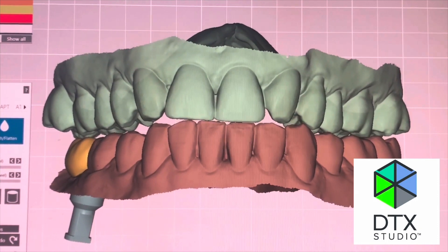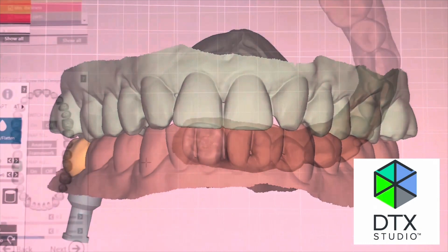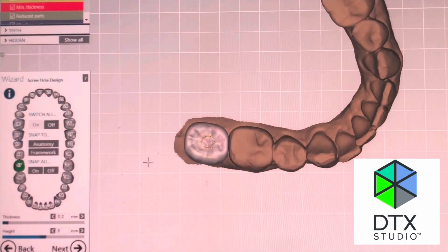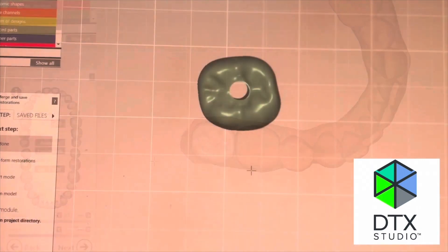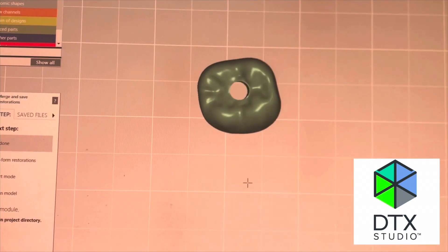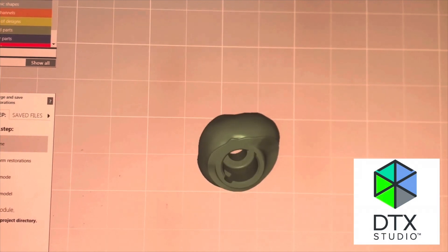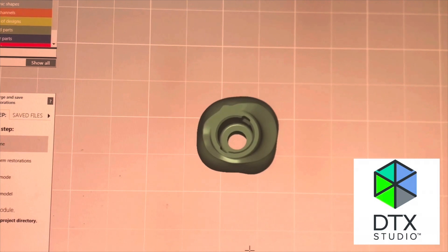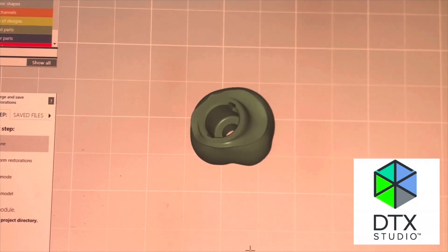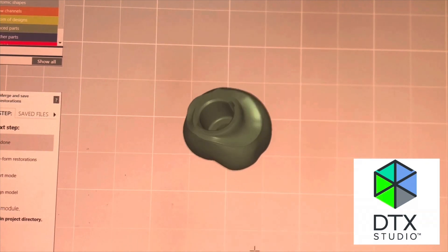After three months of healing, the patient returns and has an intraoral scan. We put this file into DTX Studio Lab where my dental technician fabricates a zirconia crown that will subsequently be bonded to the universal base. This crown can be made of any type of zirconia, and we sinter, stain, and glaze it before it's returned all prepared.